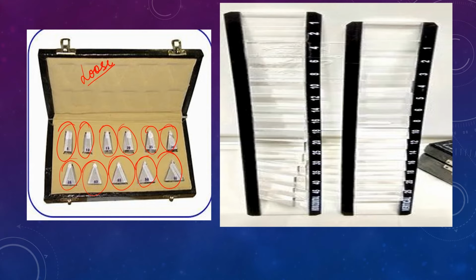And in the prism bar cover test, basically you're going to use these prism bars. Okay, so prism bars are nothing but prisms mounted in such a way, like suppose we have this horizontal bar. In the horizontal bar, the prisms are mounted in such a way that the base is going to be present horizontally or laterally, right? Like this. So this is how you have the horizontal prism bars.